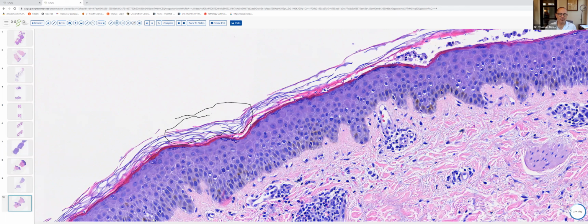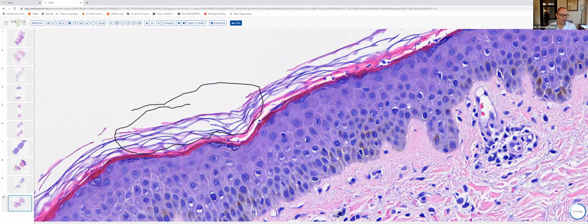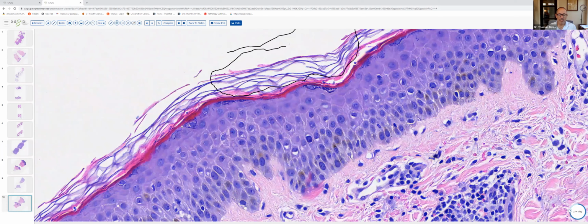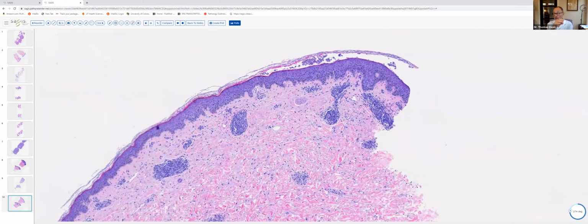When you see a two-tone stratum corneum, always look between the two slices of bread, because frequently you'll see refractile hyphal elements there. So we talked about two clues for dermatophytosis: neutrophils in the stratum corneum and a two-tone stratum corneum. A couple of other changes should heighten your index of suspicion.